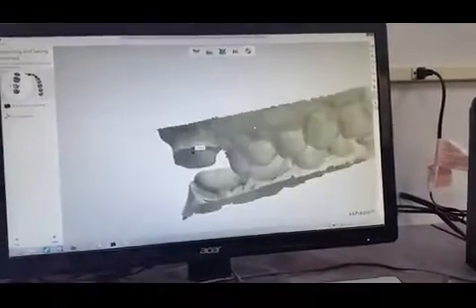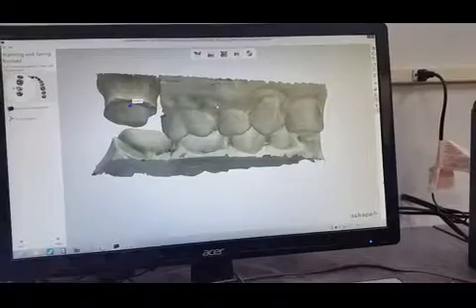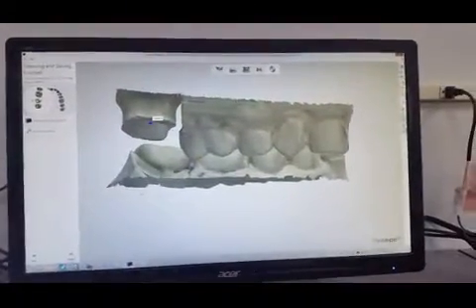And this is the final scan. This is what I got to work with. We're going to go to the design.